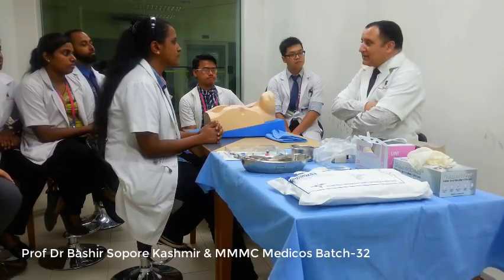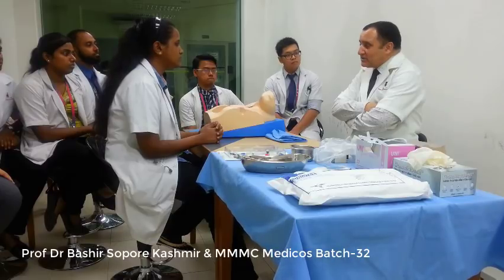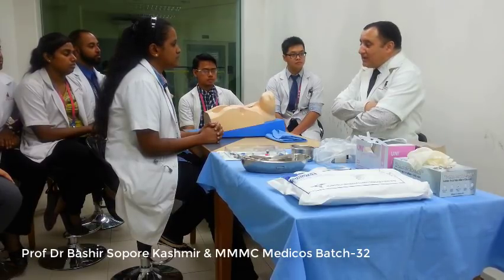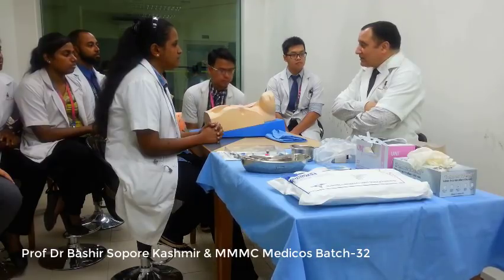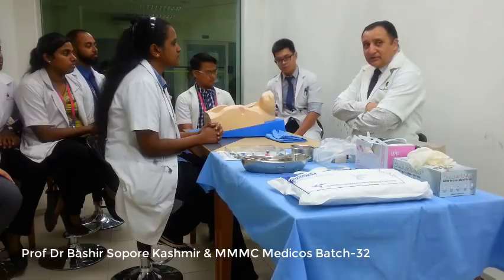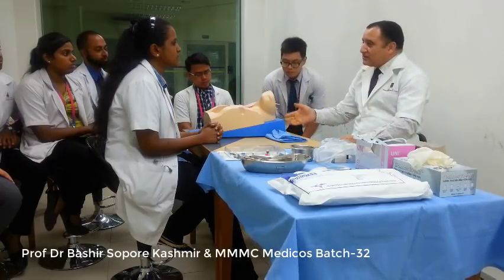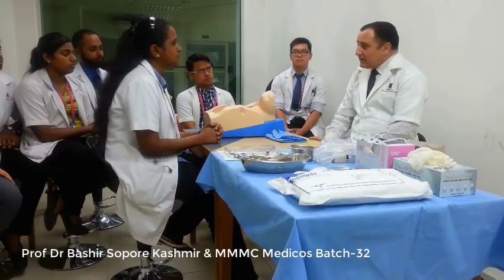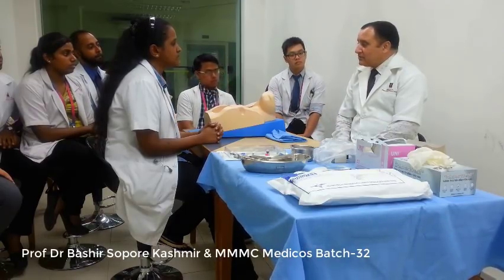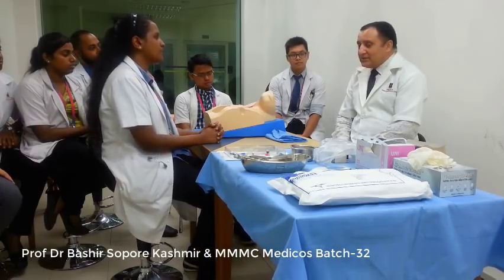Also the indications are when we have to give a large amount of concentrated fluids, or a massive blood transfusion to the patient, rapidly and in a short period of time. The other indications are cardiac catheterization, pulmonary angiography, and whenever we have to give total parenteral nutrition.